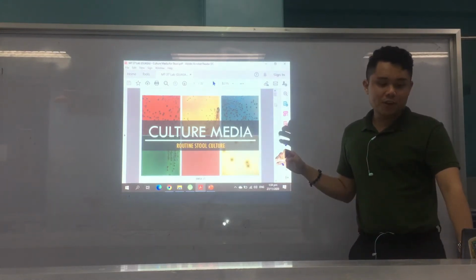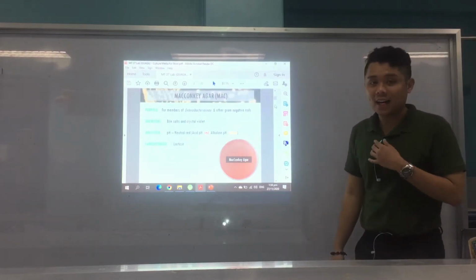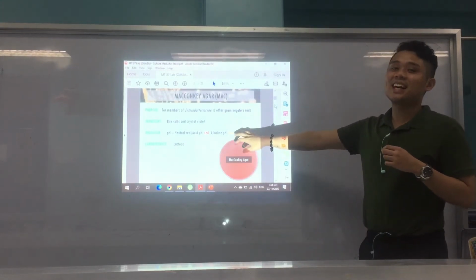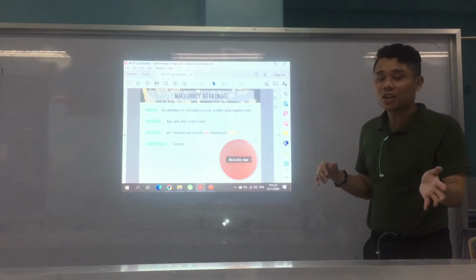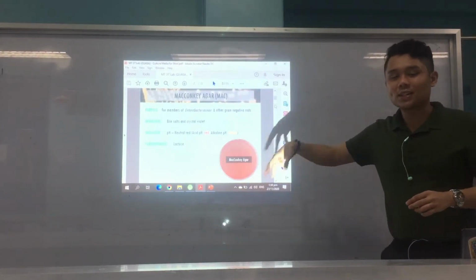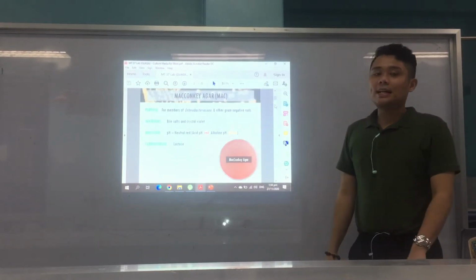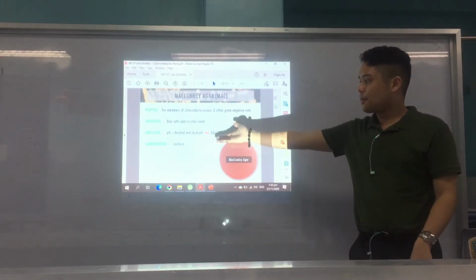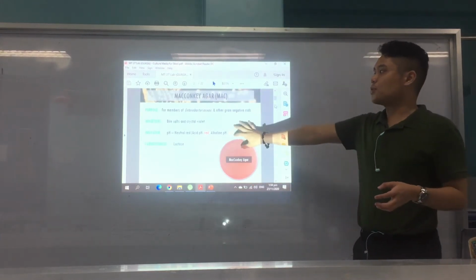Okay? So again, these are the culture media that we use for routine stool culture. Alright. So we'll start first with the first one, of course our best friend, the MacConkey agar. Okay? This has been well discussed na sa discussion natin, di ba? We've always discussed about MacConkey agar, and it's an enriched, it's a selective and differential medium. Now, for this lecture po guys, atong culture media for stool, we will talk about the different composition of the culture media, like iyahang indicators, iyahang mga inhibitors, etc. And silang purpose, okay?